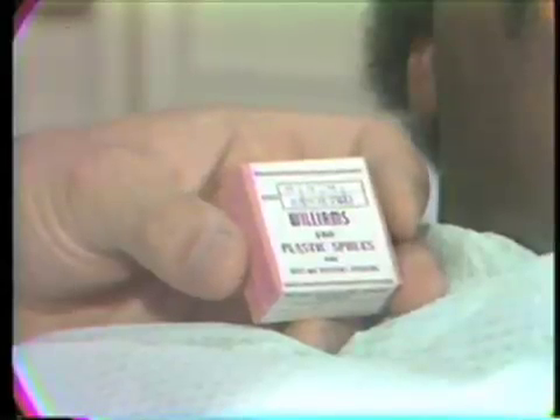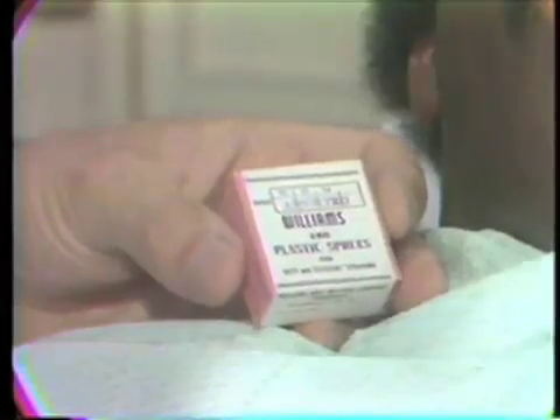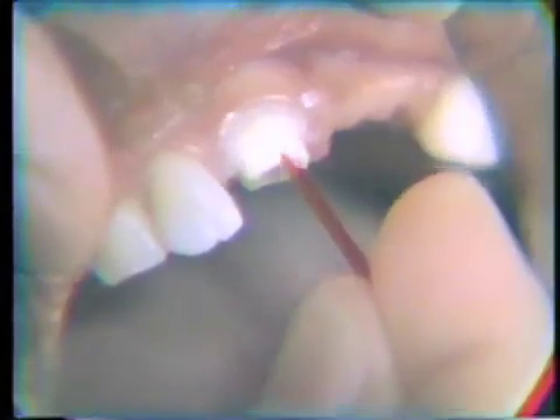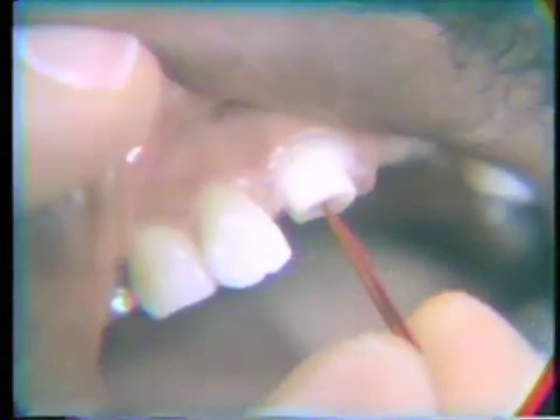We are going to take the impression of the post hole with Duralay plastic and plastic sprue pins. A box of assorted Williams plastic pins gives you a variety of many sizes. The pin is then tried in the mouth and you'll note that it has a little tip on it that will have to be removed. It is ground and tapered until it fits up into the canal to the very end.